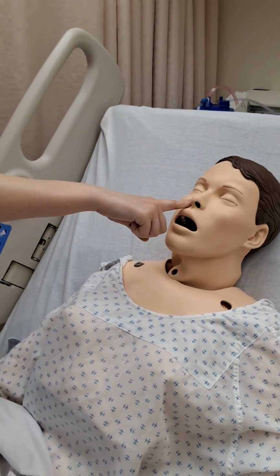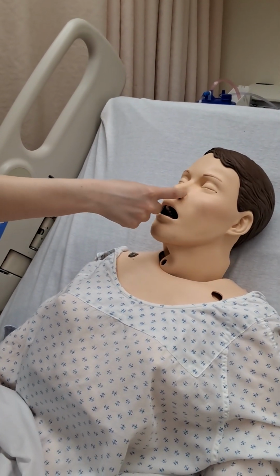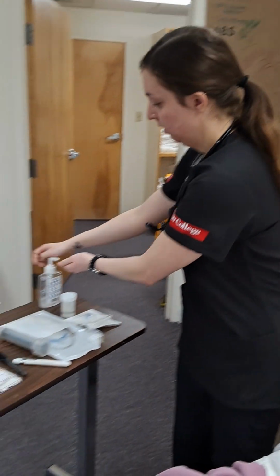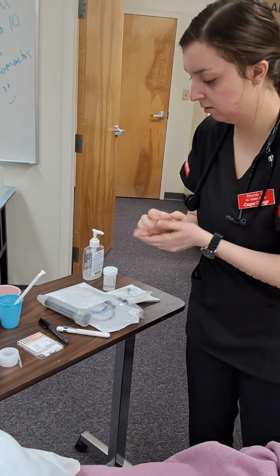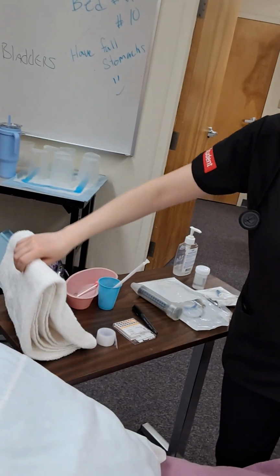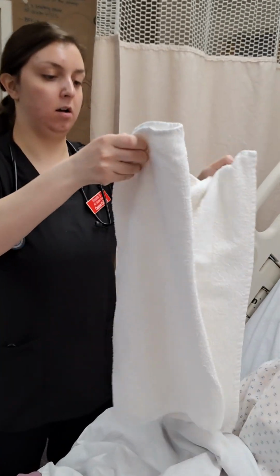Breathe in. Breathe in. Okay. So his right nare was more patent, so I'm going to insert the NG tube in his right nare. I'm going to sanitize my hands. I'm going to place this towel on you.